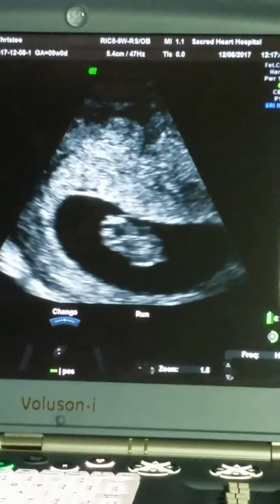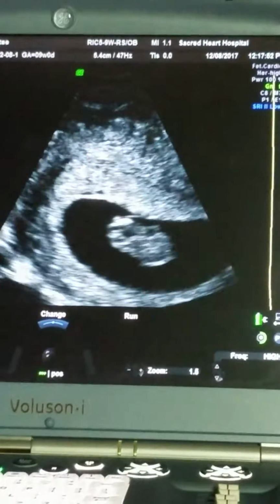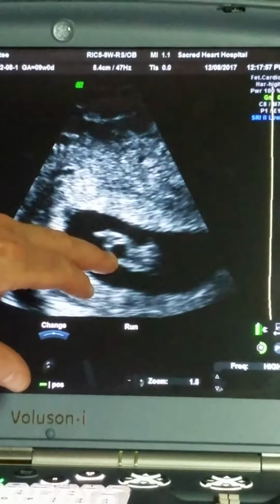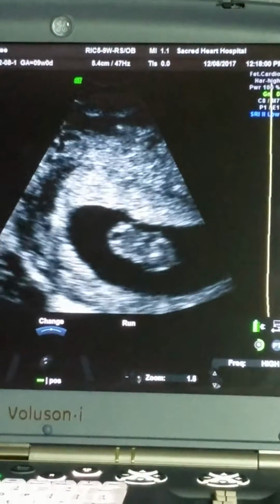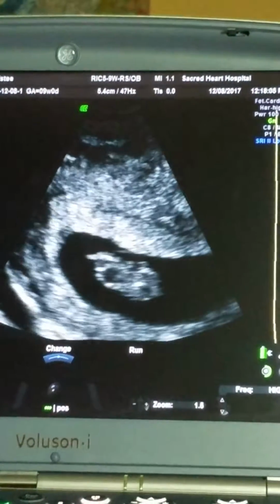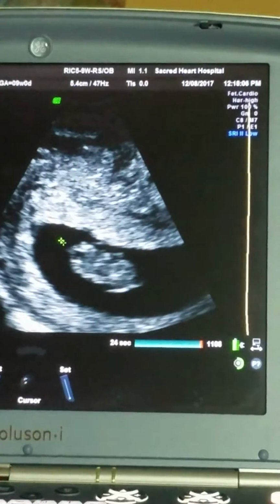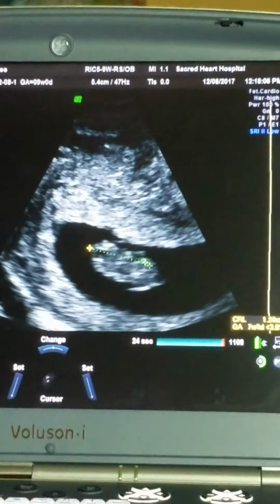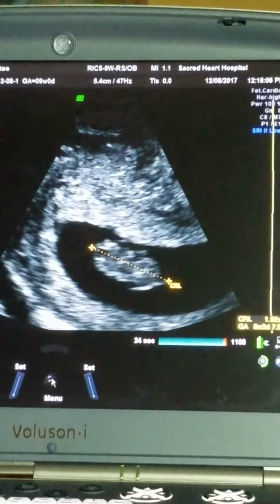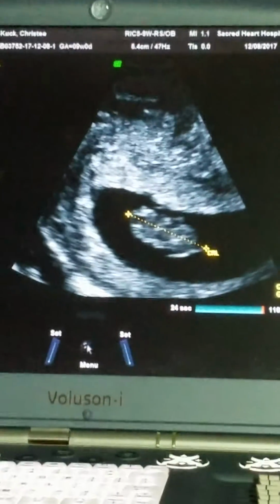And then you have a fast heartbeat in that little blob that in the next week's going to get arms and legs, like a tadpole without the arms and legs. It's supposed to have a little clear spot in its head that is where the fluid chambers of the brain and spinal cord come from. So it's normal to see that little black dot in there. And then, like I said, I'll do another measurement here. Same thing, 8 and 3. So, and that's what we'll go by, just because this is gonna have a 72-hour range of error.